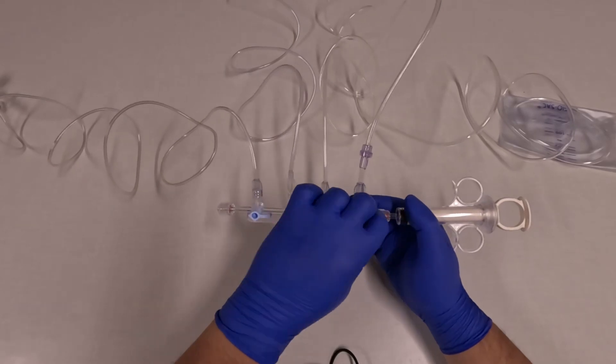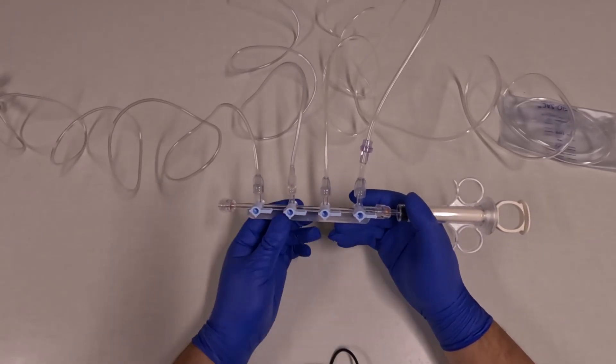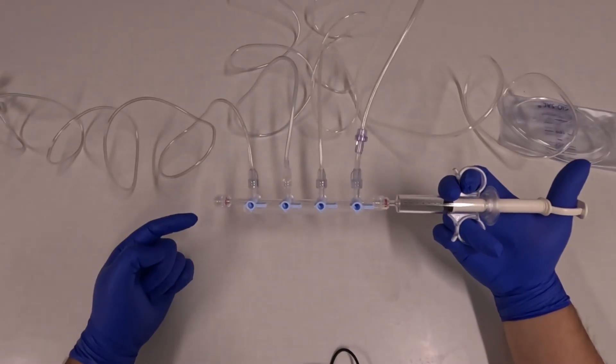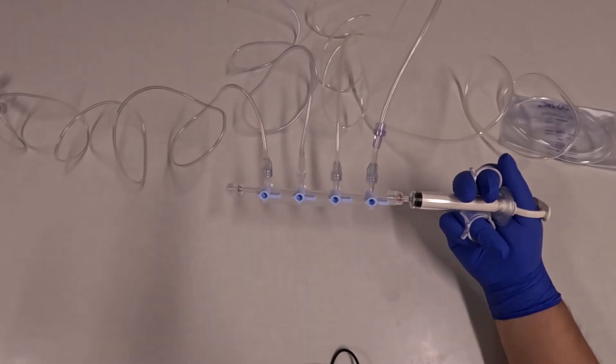You can see here I turn all the stopcocks so that there's a solid path from the patient to the syringe. If I were to pull back here, blood would enter from the patient into the syringe or push back from the syringe back to the patient.